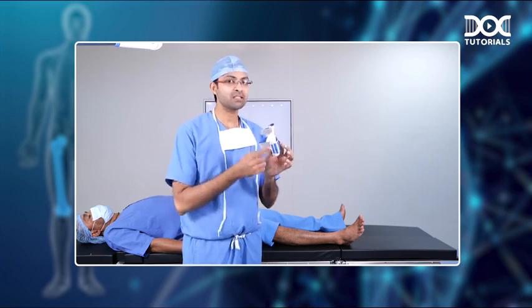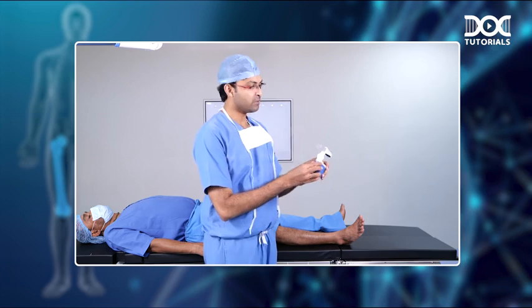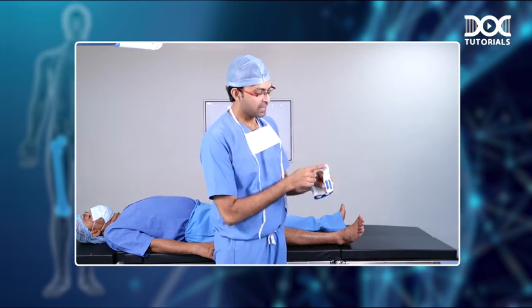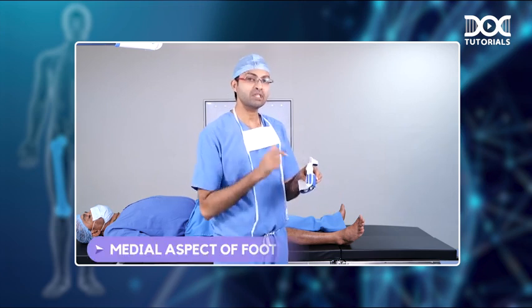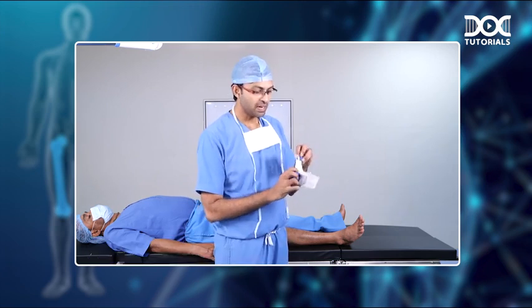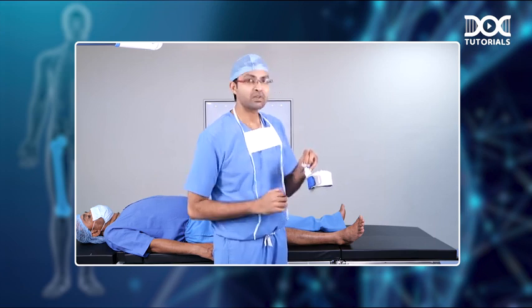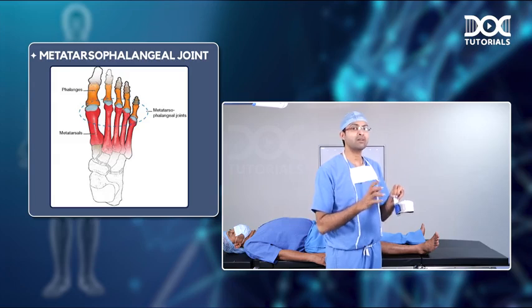Before that, you must understand the various parts of the bunion splint. So if you see the bunion splint, you will see that there is this plastic elongated area which should come on the medial aspect of the foot, and on the inside there is a cup like depression, and this cup like depression should correspond to your metatarsophalangeal joint or the bunion. Understood? So now I will show you how to put the bunion splint on the foot.